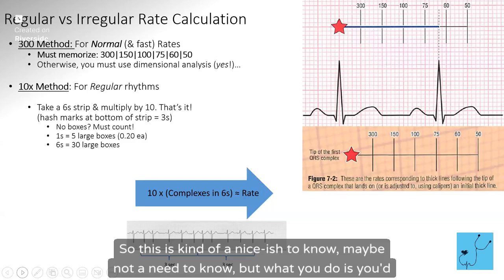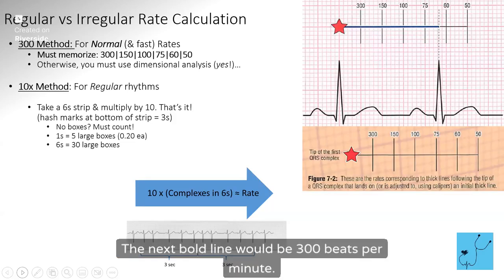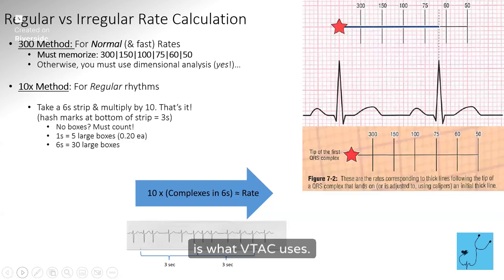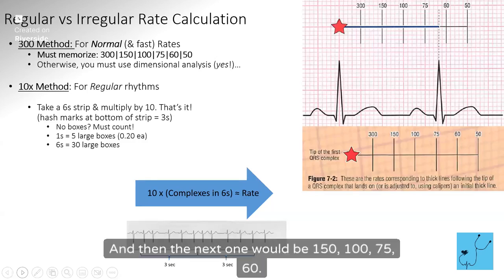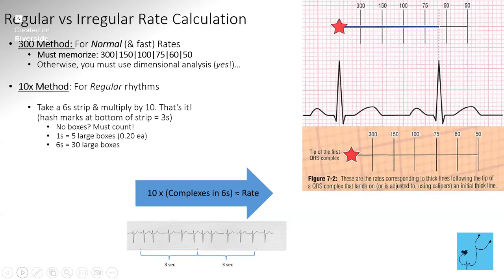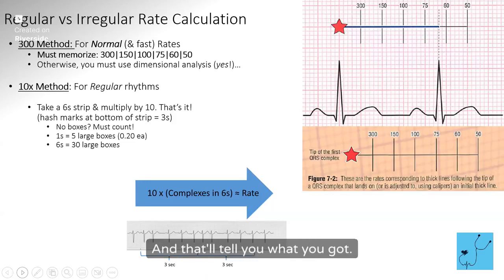So this is nice-ish to know, maybe not a need to know. What you do is you find a QRS on a bold line. The next bold line would be 300 beats per minute. So if I had a QRS here, then my heart rate would be at least 300 beats per minute, which is what VTAC usually does, right? And then the next ones would be 150, 100, 75, 60. So this one is between 60 and 75. Okay, so it's probably a normal sinus rhythm. Also, if you have a regular rhythm, then you can just count in a 6-second strip and multiply by 10, and that'll tell you what you got.